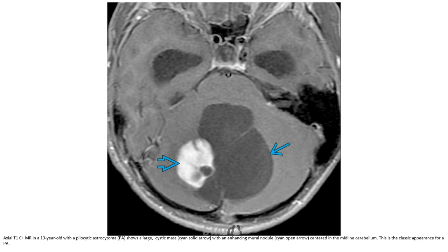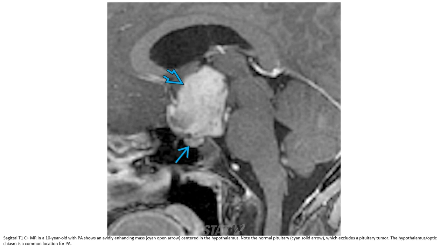This is the T1 C-plus image in a 13-year-old, showing a large cystic mass with an enhancing mural nodule centered in the midline cerebellum. This is the classic appearance for a pilocytic astrocytoma. A T1 C-plus image in a 10-year-old with PA shows a heavily enhancing mass centered in the hypothalamus with a normal pituitary, which excludes a pituitary tumor. The hypothalamus and optic chiasm is a common location for pilocytic astrocytoma.